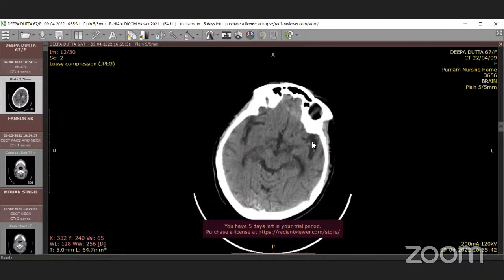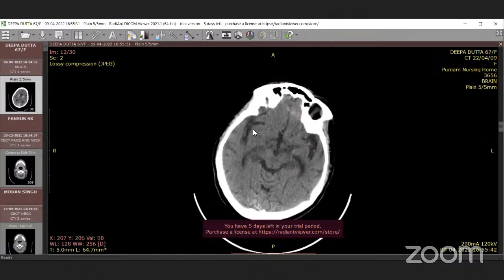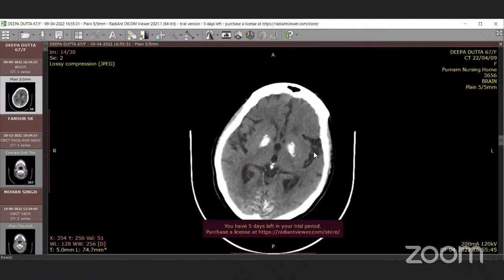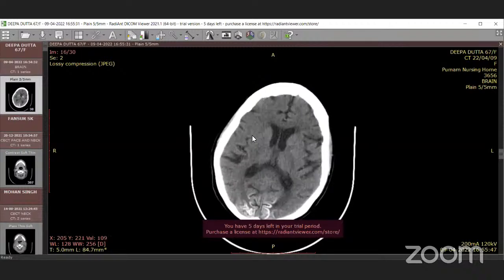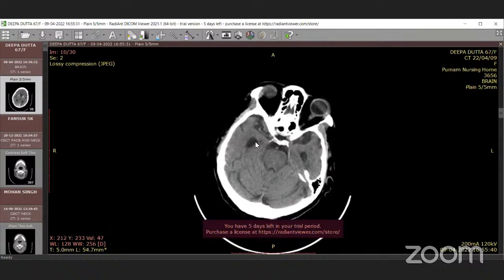Okay, this is the level of the Sylvian fissure, the biggest black structure on either side of the temporal area. This is the temporal bone on either side. Just medial to the temporal bone is the CSF-filled structure, the Sylvian fissure, through which the middle cerebral arteries and their branches course. The superior extent is where the operculum of the frontal lobe closes off the fissure, and the inferior most is at the level of the temporal operculum, the temporal lobe, where it closes off the fissure.